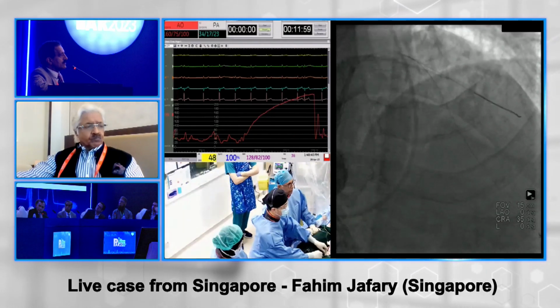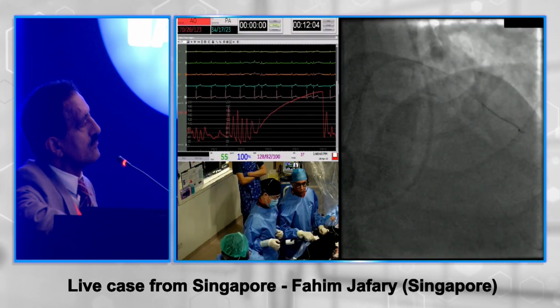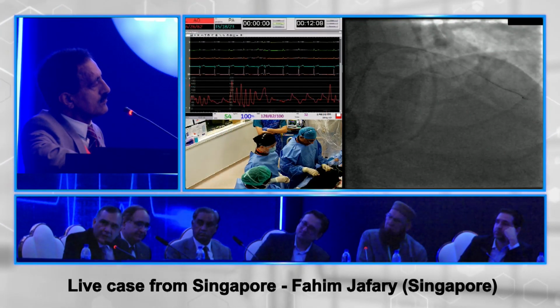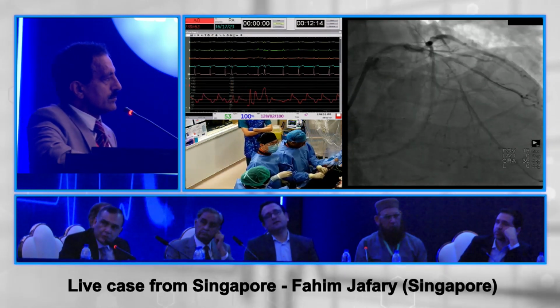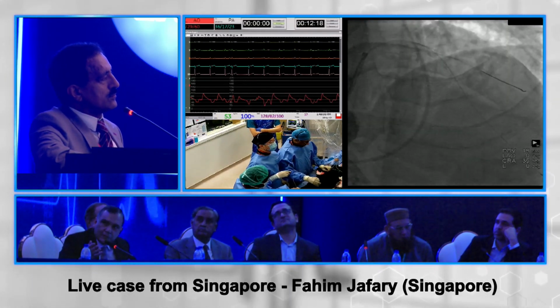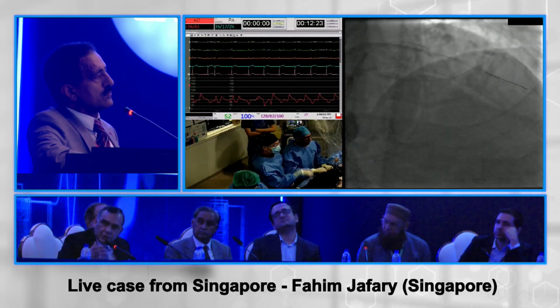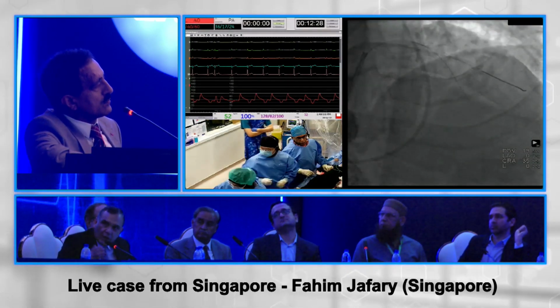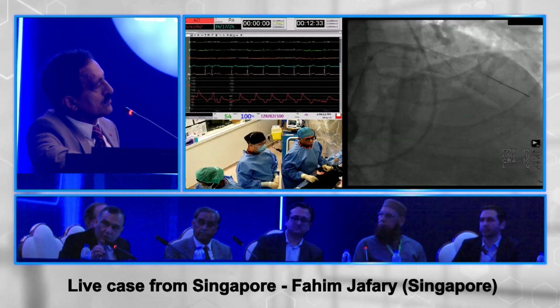Can I make a slightly provocative point about underexpanded stents. In a calcified vessel, just for the fellows, there is a difference between malapposition and underexpansion. If you've got IVUS and your stent is showing 20 to 30% underexpansion, and you keep pushing with an NC balloon and it doesn't expand, there's no harm in leaving it as such if you've seen that it's properly apposed.